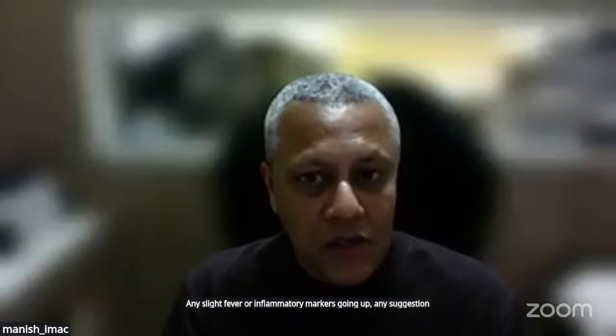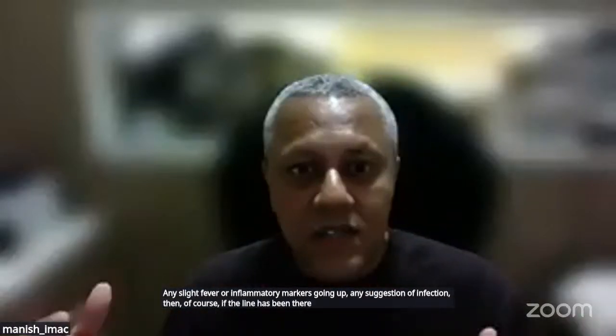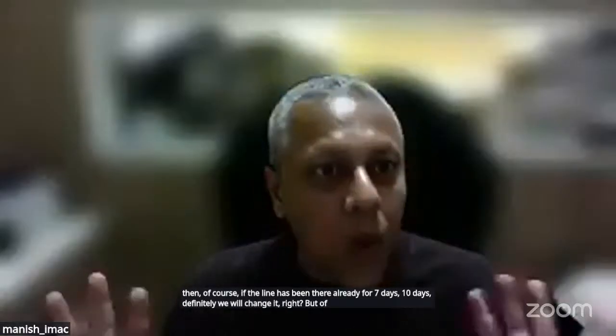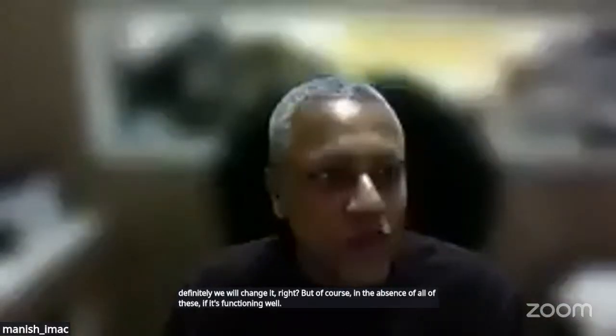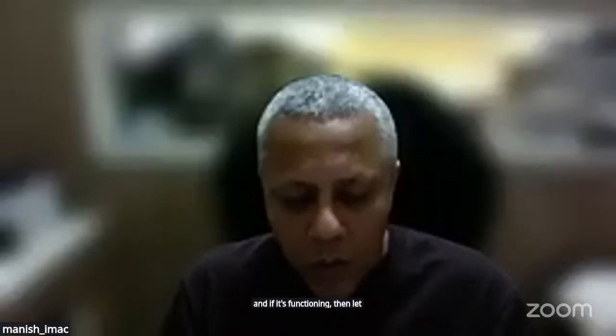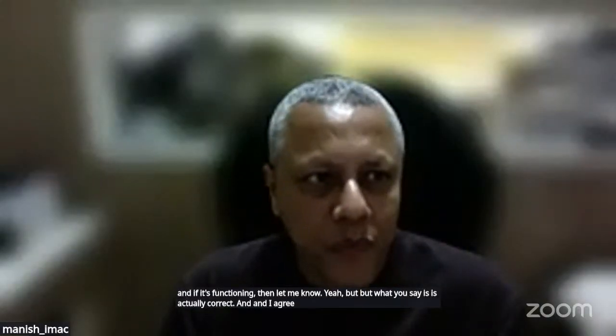suggestion of infection, then of course, if the line has been there already for 7 days, 10 days, definitely we will change it, right? But of course, in the absence of all of this, if it's functioning well, there's no signs of infection or anything. And if it's functioning, then I may not. Yeah, but what you say is absolutely correct. And I agree with that.